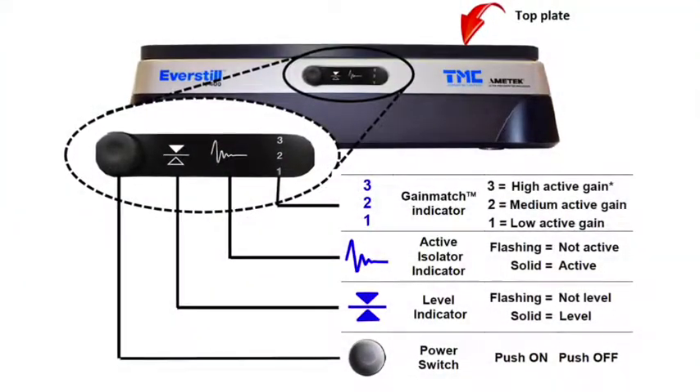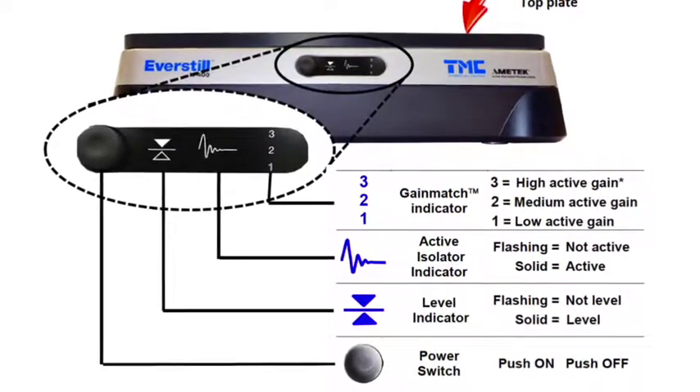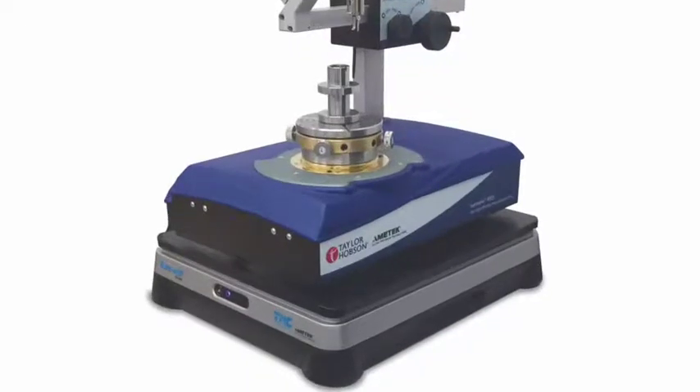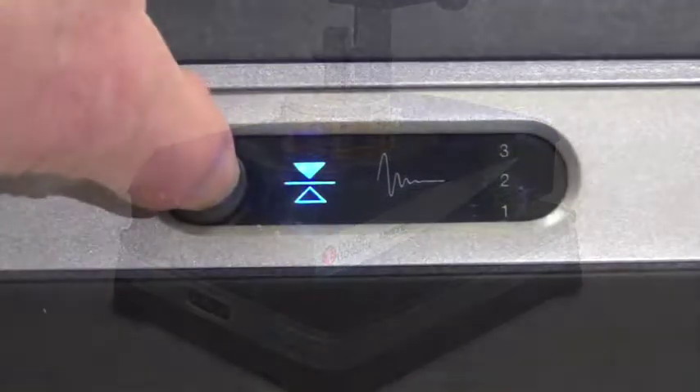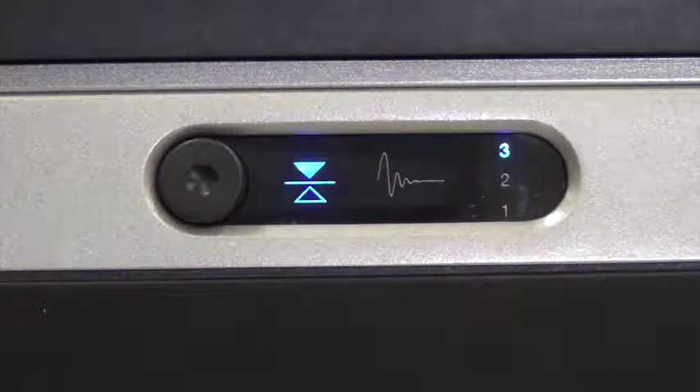The front panel includes the power button as well as the indicators for the level of the top plate, active isolation, and gain-match. With payload in place, simply power on the unit. The K400 automatically senses an uneven payload and levels the top plate.